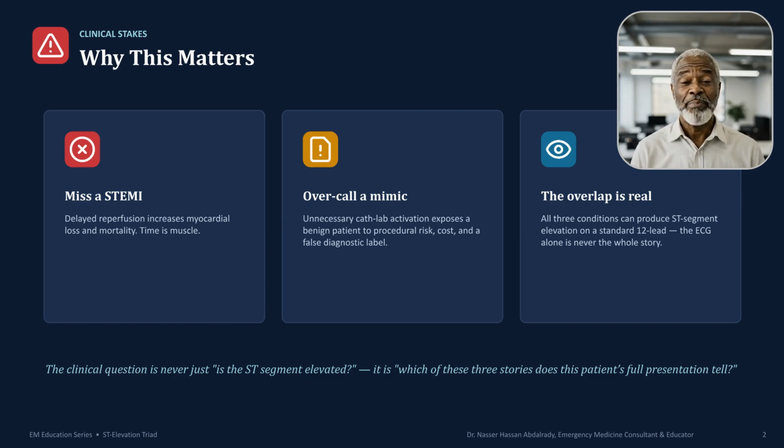Why does this matter? Missing a STEMI delays life-saving reperfusion, while overcalling a mimic exposes patients to unnecessary risks. Because all three conditions can show ST elevation, the ECG is only part of the story.